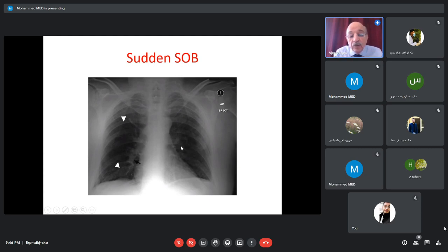Okay, I know this is difficult, and probably you will say this is difficult to diagnose pulmonary embolus. Pulmonary embolism is better diagnosed by a CT of the chest. You are right. But by the time you get CT of the chest, it may be too late. If you see a patient, say with a fracture of the femur, these patients are prone to pulmonary emboli, or a woman in labor on the obstetric side who suddenly presents just like this with shortness of breath and maybe associated chest pain as well, suspect pulmonary embolus.